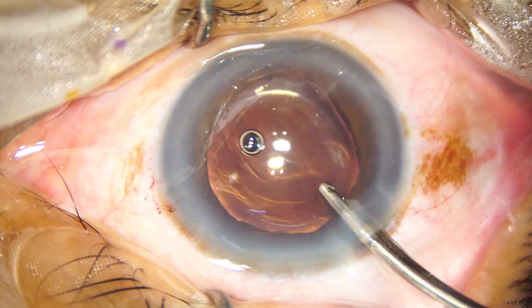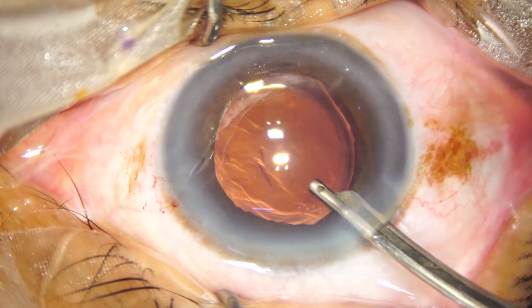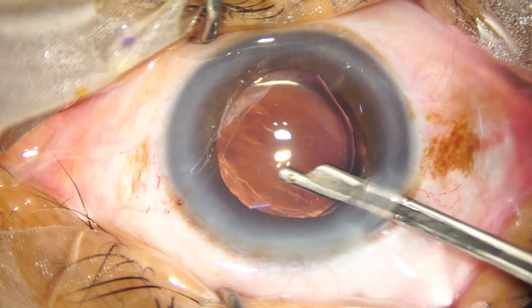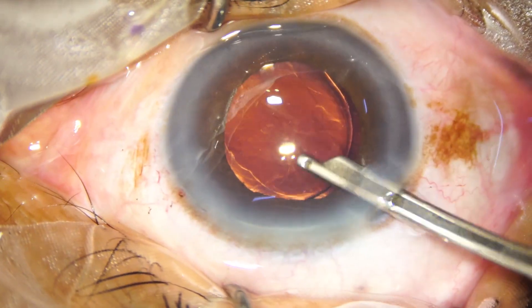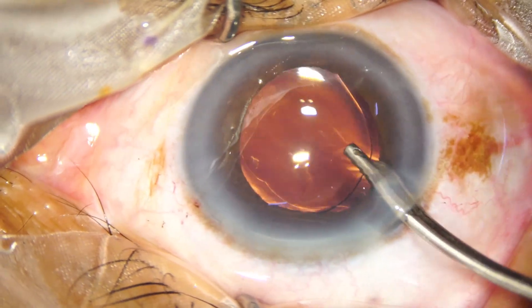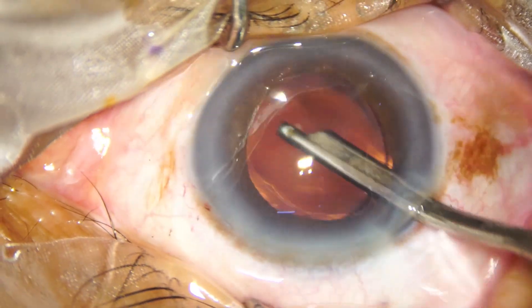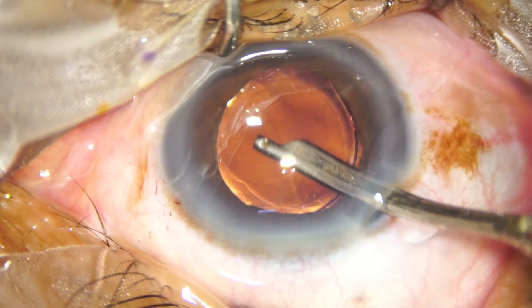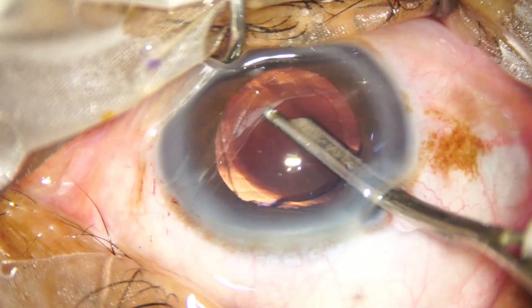When viscoelastic substance is used for implantation of the intraocular lens, it is important that we go behind the intraocular lens and clean the viscoelastic between the lens and the posterior capsule. Unless this is done, the patient will have a raised intraocular pressure in the postoperative period.